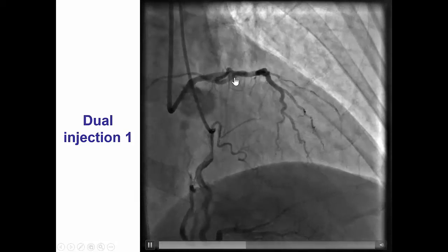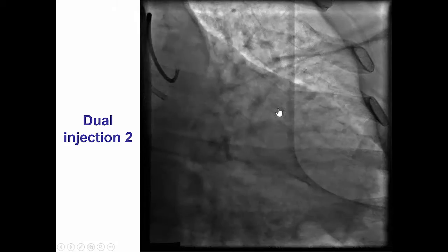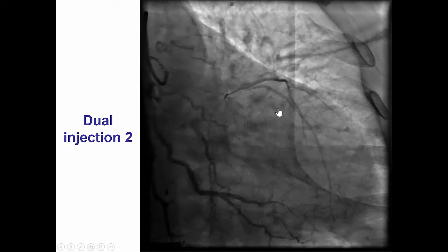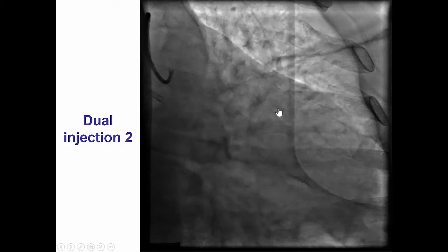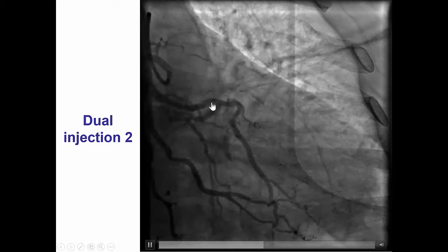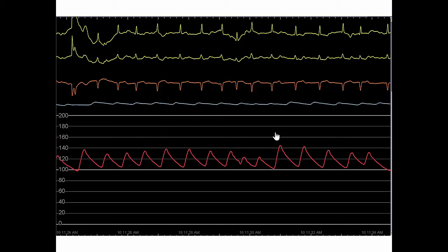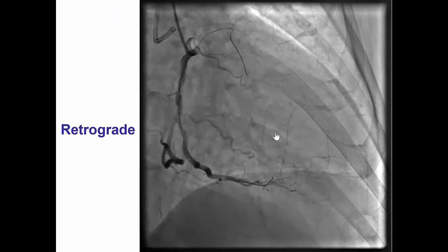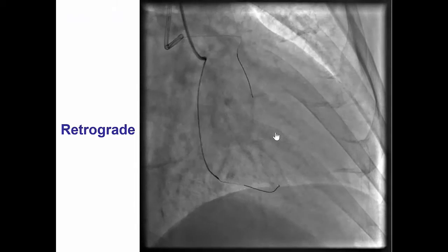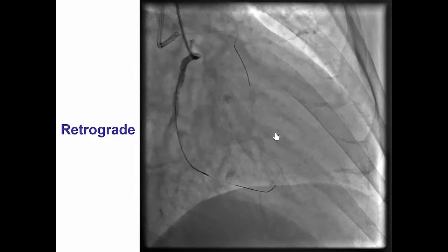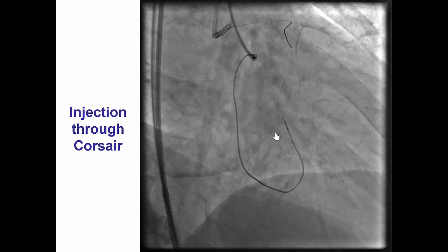It is still hard to determine where the ostium of the LAD is, so there remains a proximal cap ambiguity. That persists even after doing a caudal view — it is still unclear whether the takeoff of the LAD is more proximal or more distal. The patient was stable with good hemodynamics at the beginning of the case. Because of the ambiguity, we decided to do a primary retrograde approach. Therefore, we advanced a retrograde wire from a septal collateral all the way to the left anterior descending artery.